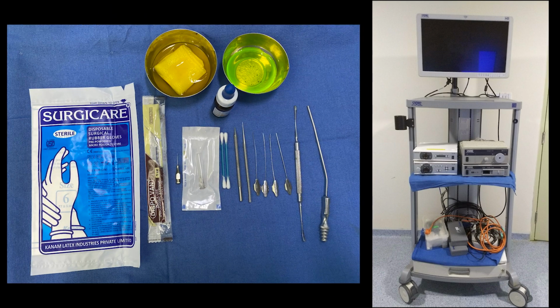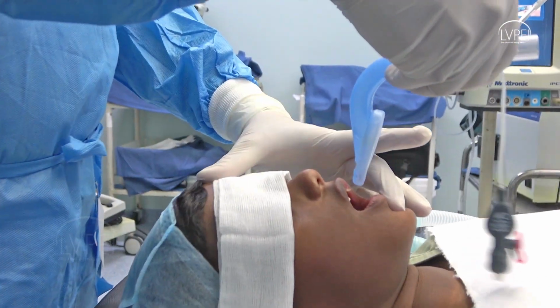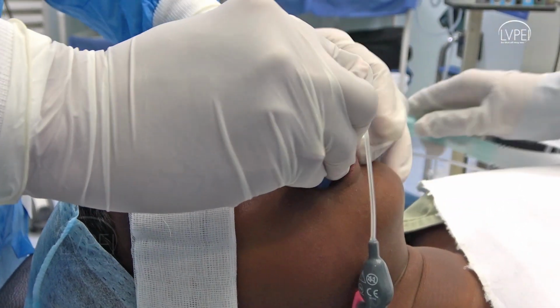The instrumentation needed apart from the endoscopy system is mainly a 1 ml syringe, 23 gauge cannula, short taper Nettleship punctum dilator, Bowman's lacrimal probe, periosteal elevator, and suction cannula along with the apparatus. The procedure is performed under short general anesthesia with a laryngeal mask airway.